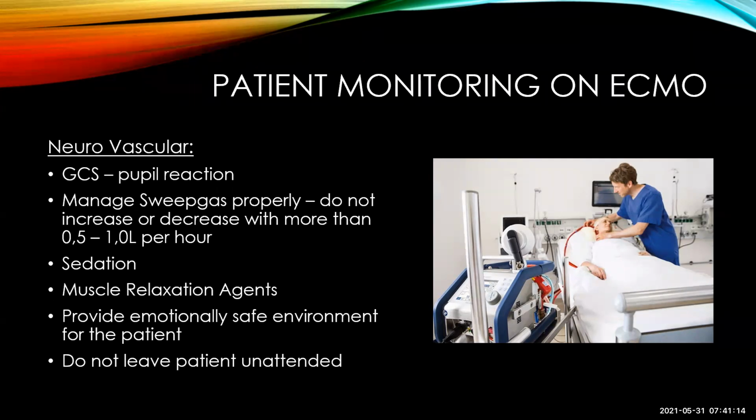And please don't leave the patient unattended. If you need to go for tea or something, get someone else to sit there while you're not there so that they stay calm and they are not alone. Okay, so neurovascular, that's all about there.